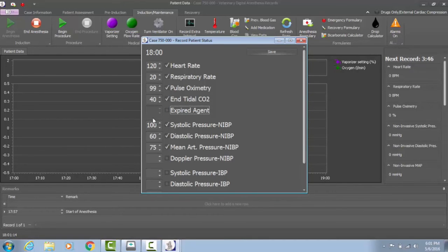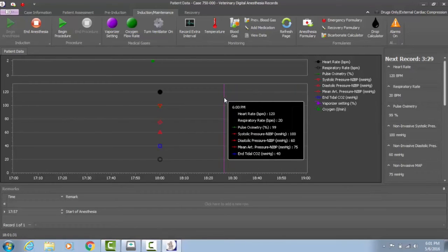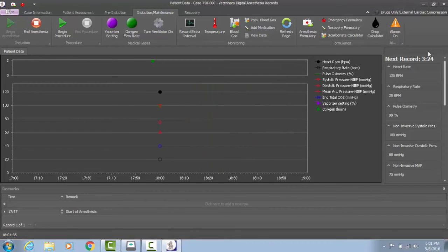And if for some reason you don't have your blood pressure on the first reading, you can always get it on the second. So just don't enter any numbers in and make sure your boxes are unchecked. Then you'll hit save. And then it'll keep counting. So it's kind of nice because you can always keep your window up. So if you don't get it just so the very second that it popped up, it'll stay up. And it'll keep counting for the next 5 minutes. So if it takes you a little bit longer on the first reading, you might have another reading pretty quickly after that.